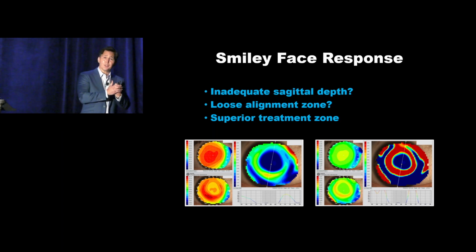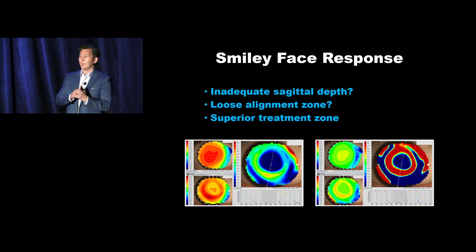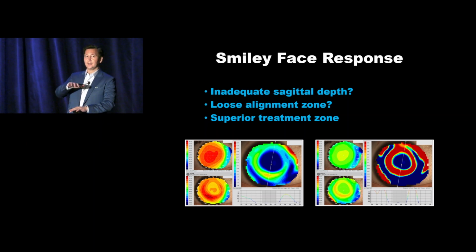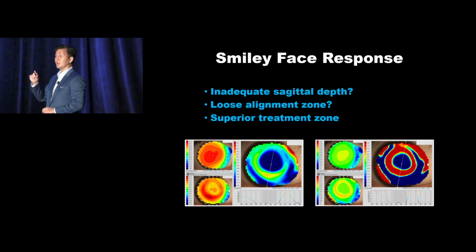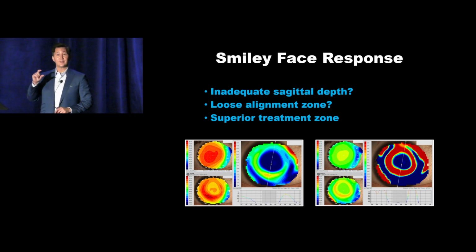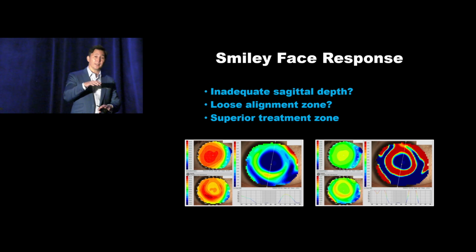If you have a patient that's got lots of central corneal staining, the lens is crashed into the central cornea and it's decentered high, that's a lens that needs the height increased. The lens is too low, it's touching the central epithelium. Do you remember how much apical clearance we said a good orthokeratology lens should have? Like 5 to 10 microns. So if the lens is crashing into the central cornea, that would be no good. We need to raise the height of the lens.